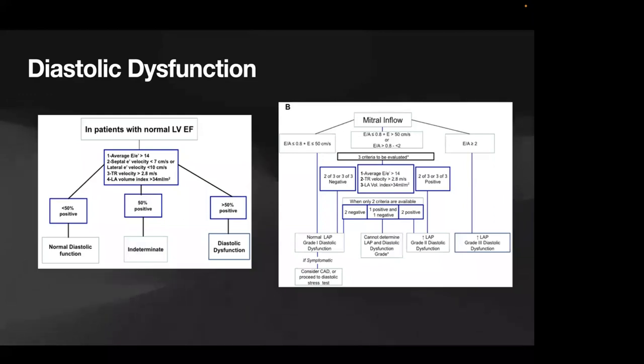The key thing I wanted to point out is we're going to focus in on that little box in the middle, because those are what we believe to be the determinants of diastolic function or dysfunction as a surrogate marker of left ventricular filling pressures. So we're going to break these down.